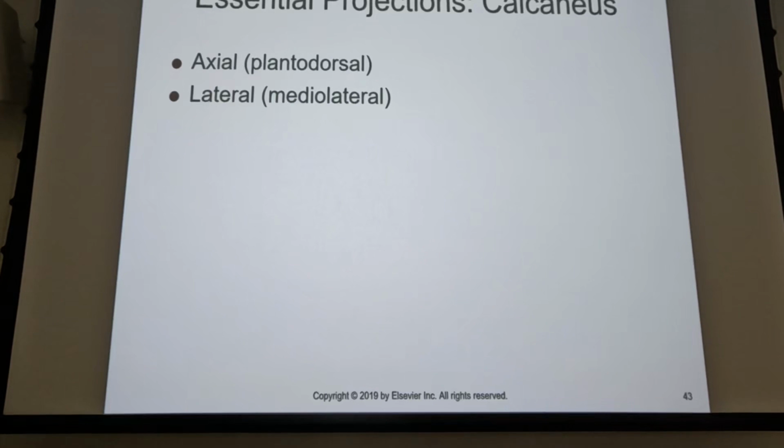So another option, if you look on page 312, that's another option. You can shoot it dorsoplantar. Not sure that that's on the test, but from a clinical perspective, that might be an option for you.